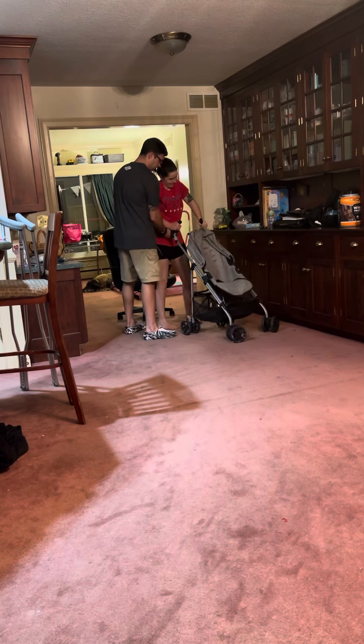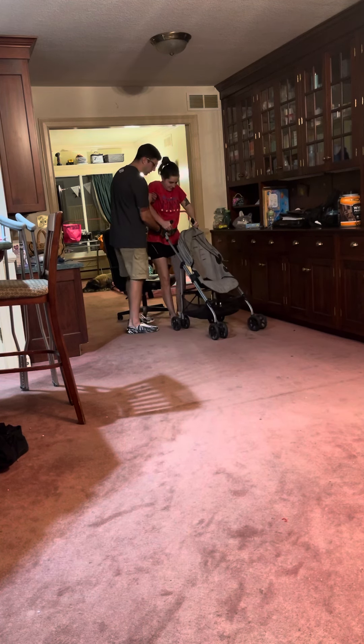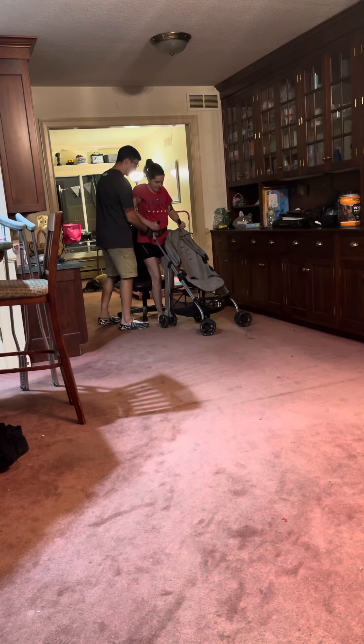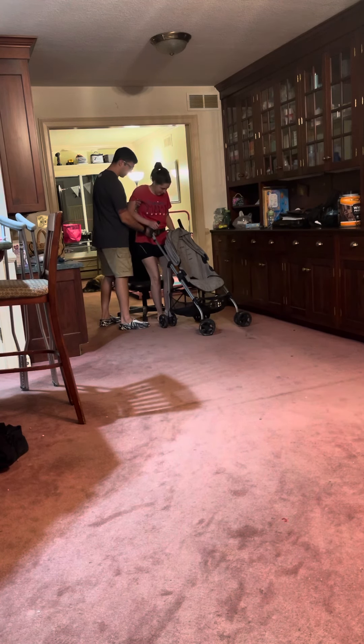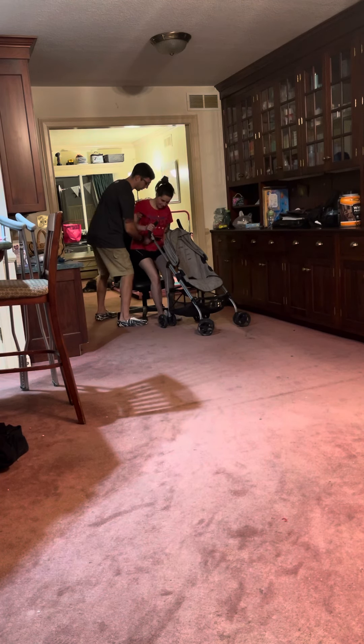There you go. That's perfect. Now go ahead and ease on back for me. Bring that walker with you until you feel the edge of the chair and the back of your legs. Go ahead and reach back with that left hand for me, and reach back. One, two, three — sit down.